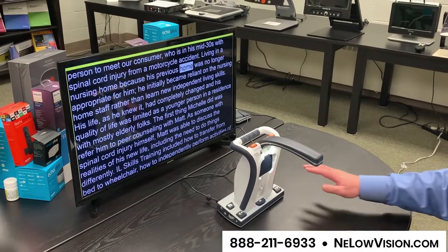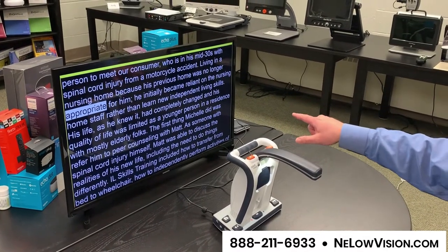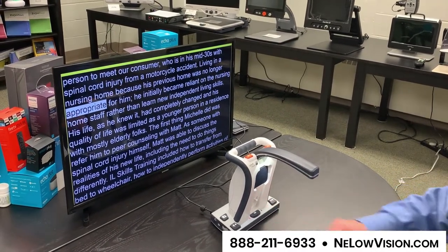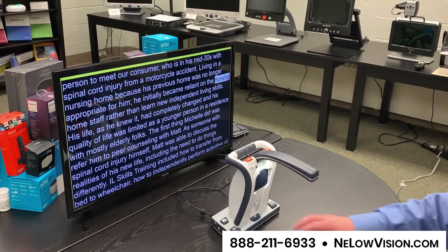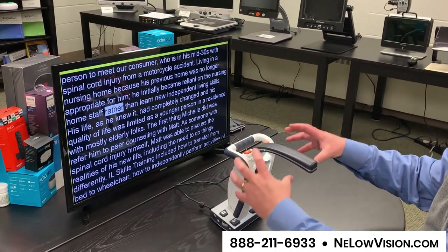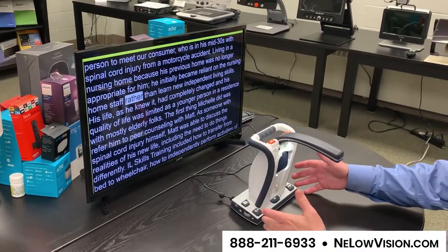I'll jump one line ahead and it reads: 'Appropriate.' Then it stops. Now you know where you are, and pressing play continues: 'Appropriate for him. He initially became reliant on the nursing home staff rather...' All of your controls are embedded right into the device — really good sound, speed and volume dials. If you attach an HDMI monitor it looks really nice.